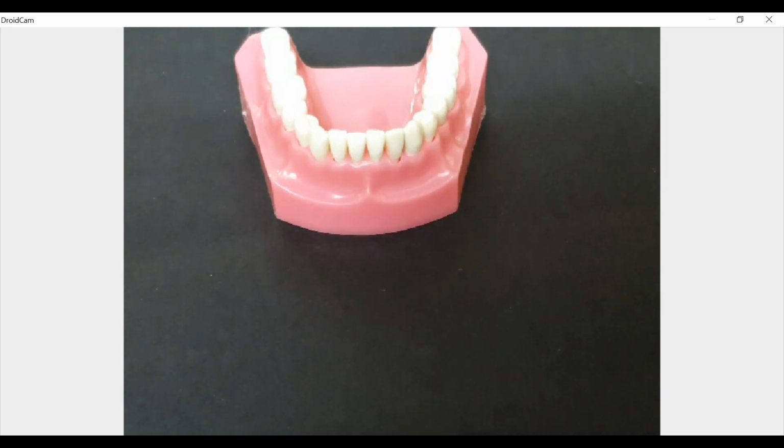isolated, whether the tooth has all four walls, which are important if you are clamping that tooth, whether it is a badly broken down tooth, whether the tooth is tilted mesially or distally, whether the tooth is rotated, whether the adjacent teeth are strong enough, because this is particularly important if it is a restorative procedure, because you will never clamp the tooth that needs to be restored. You will always clamp the tooth behind.